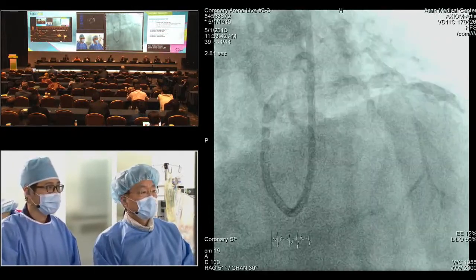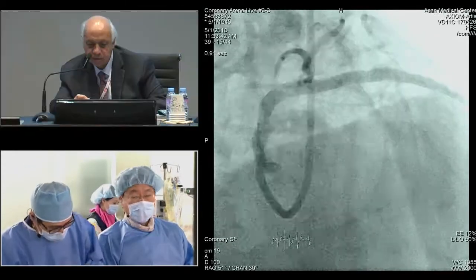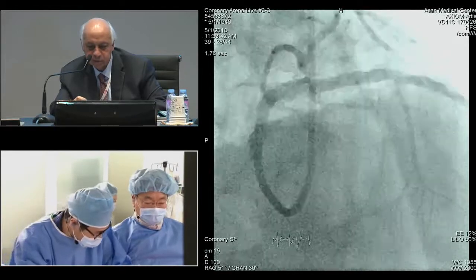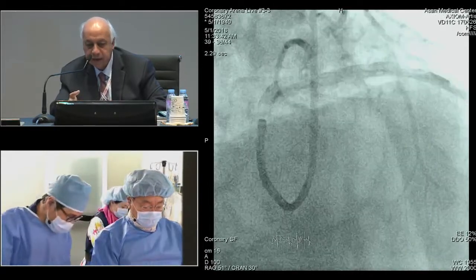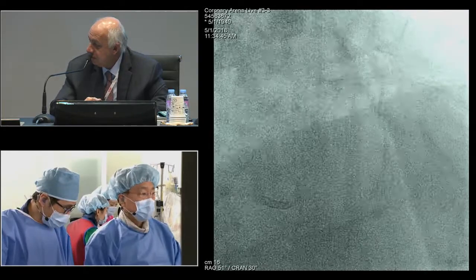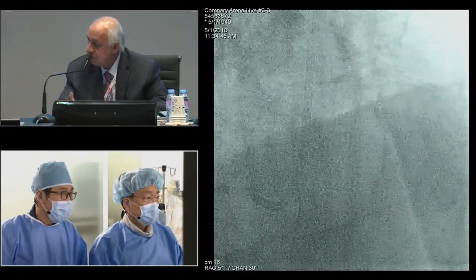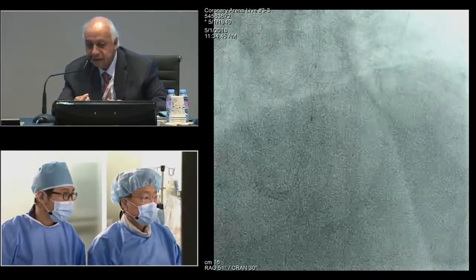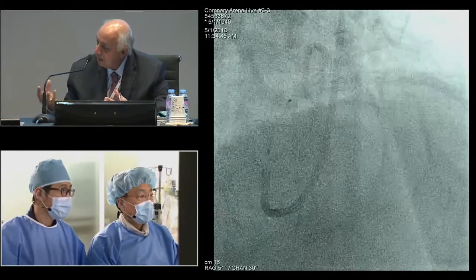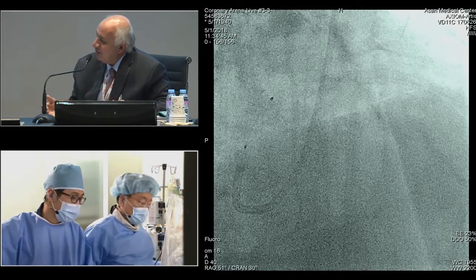SJ, regarding the calcium treatment, if you are using an IVUS and you see that calcium is eccentric or concentric in the amount and the bulk, this justifies for you to start rotablator or AngioSculpt, Shockwave, or non-compliant balloon. And if you find that you go non-compliant in one vessel, this justifies it for the other vessels as well if you are not satisfied with the IVUS results, because you said that in the right coronary there is also calcification. So why do you do an IVUS in the right coronary? Do you do the same? Because this could be a kind of calcium which differs from one patient to the others. It's the amount of the calcium, the bulk, or the type of the calcium, or the eccentricity of the calcium which justifies which technique you're going to use.